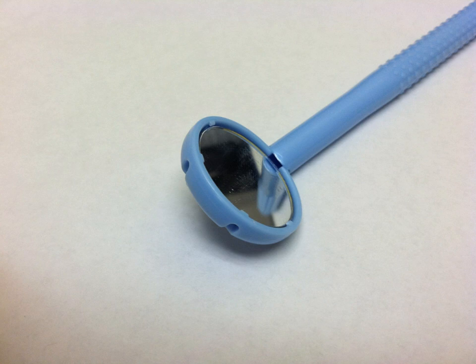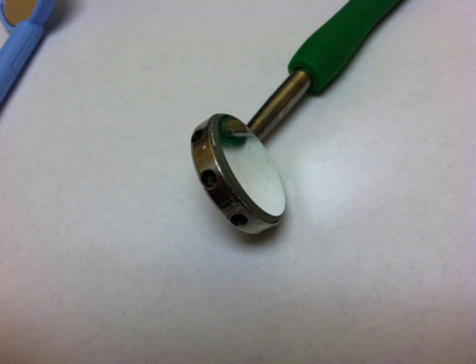This is the Diodent version. I've been using these for a long time — this one is kind of beat up as you can see in the picture. I think it's a size 4 mirror. It's got holes on the side and holes in the back, and we'll see a better picture of that shortly.